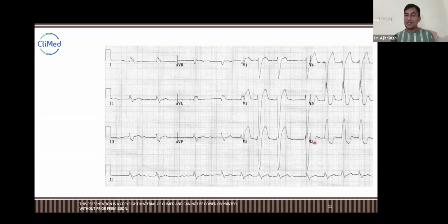Okay. So if you look at this, this is M. From here it starts. This is M. Okay, and from here it is W. So this is not M, this is W. Check this, guys. Here, this is W. From here it starts. That's why I kept a very complicated ECG, and this is W. And if you cannot see here, check this. This is W.